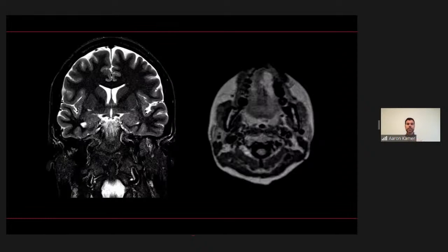So the neurologist said in his report, right mesial temporal sclerosis. And because he had looked at the images, he put in parentheses, curious neuroradiology finding reported as isolated amygdala enlargement. So he basically was calling me out in his report that he didn't believe me. But then a few weeks later, I followed up on the patient and found that there was an EEG that vindicated me, that had found seizures coming from the left temporal lobe.